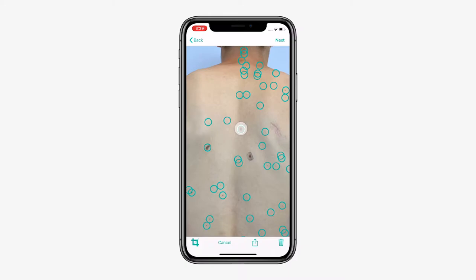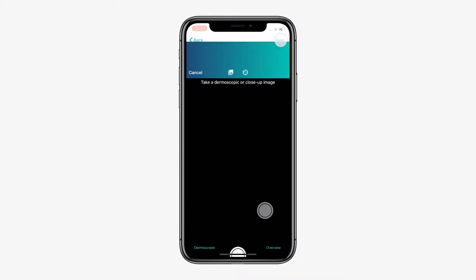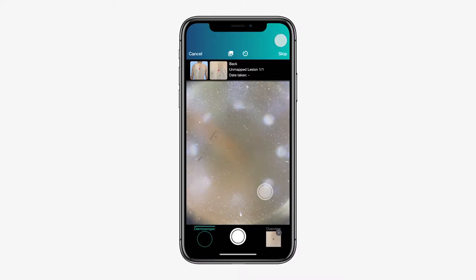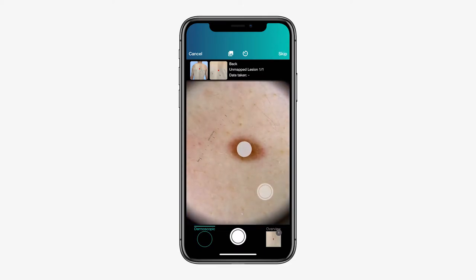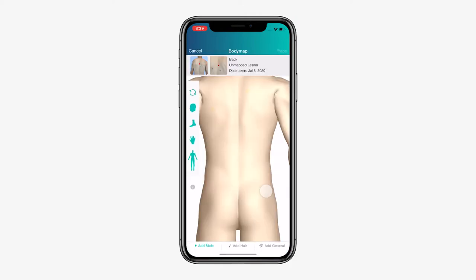Hit next and attach your mobile dermoscope to your smartphone. For the best imaging quality, make sure your phone and device's lenses are clean. Remember to tap to focus on the spot. When focused, tap the camera button to take your image. Once done, the app will prompt you to place the spot on the 3D body map. Simply tap the corresponding area on the body to place. Once happy with the placement, press place to finish.